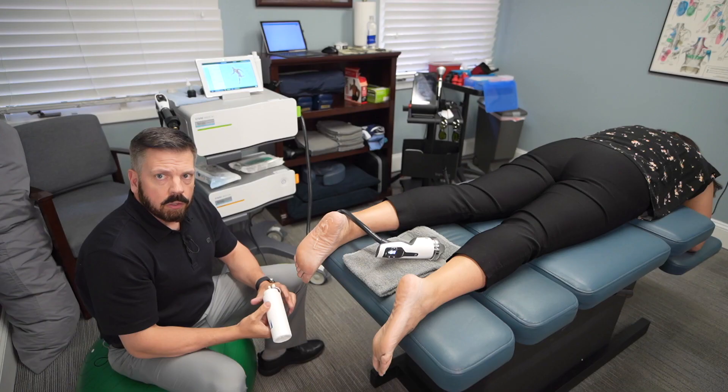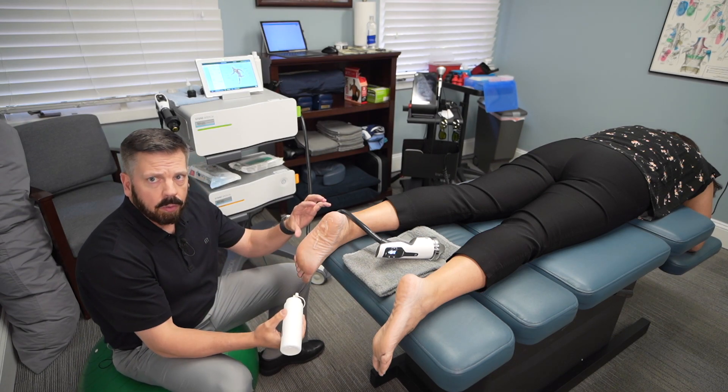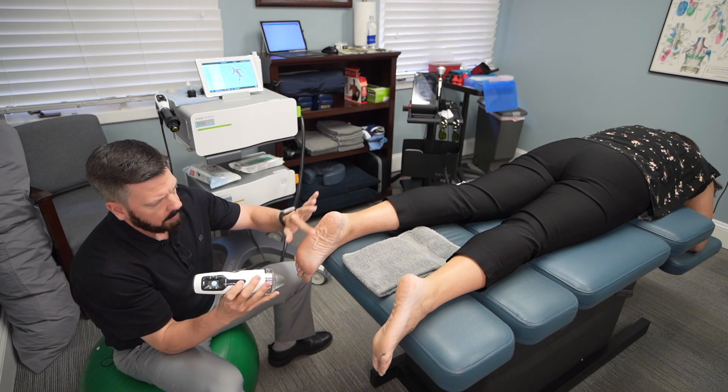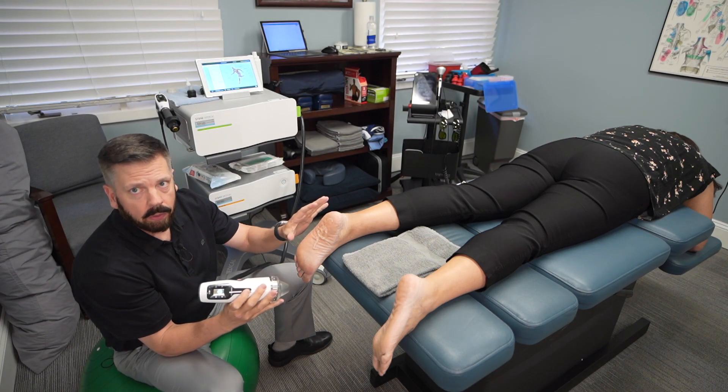In this video I'm going to show what a focus shockwave therapy treatment looks like, and then I'll discuss some other treatments we do to support it. When using focus shockwave, we apply a little ultrasound gel to the plantar fascia and then apply the focus shockwave all the way from the heel into the arch. When we get over normal tissue the patient won't feel anything.